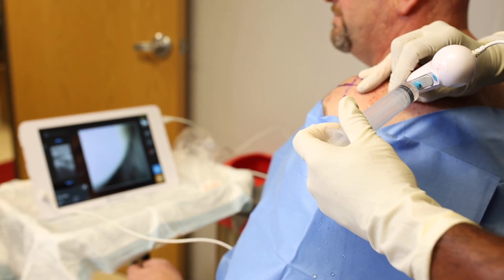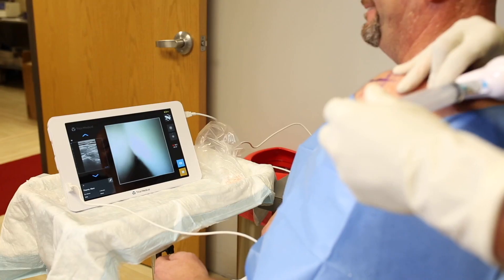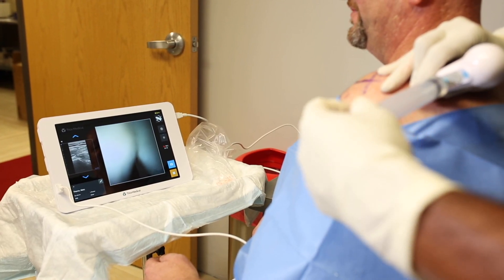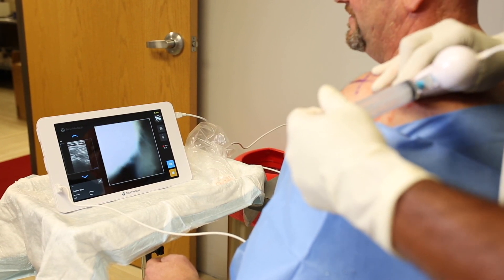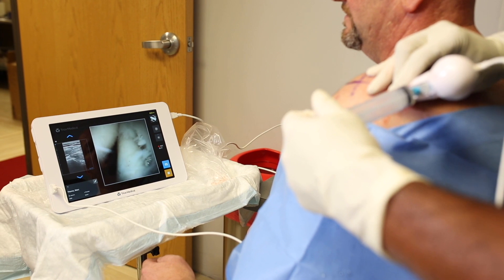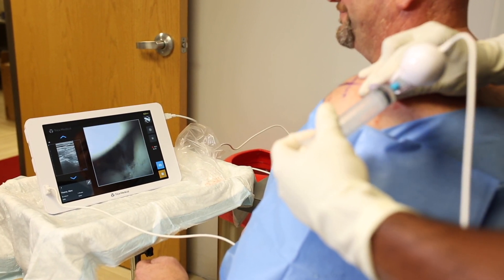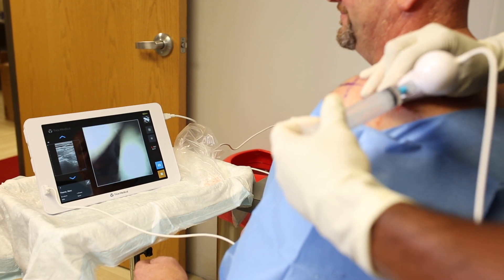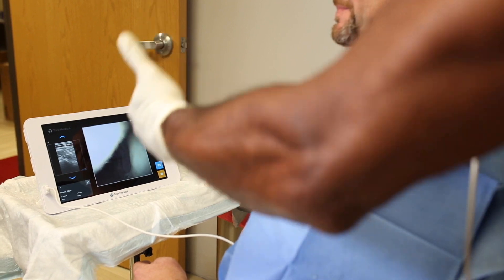Our goal is to do these procedures in a relatively short amount of time. The actual procedure time is hopefully five minutes, maybe ten minutes at the most if there's a lot to look at — usually we have one or two clinical questions and can answer those very quickly. At the end of the procedure, we try to remove as much normal saline as possible, using syringes to aspirate the joint.